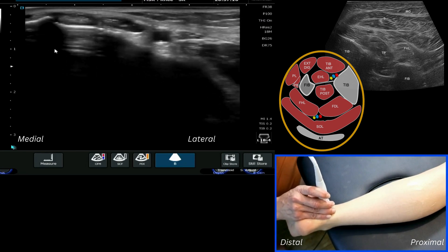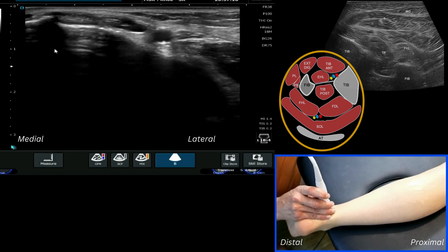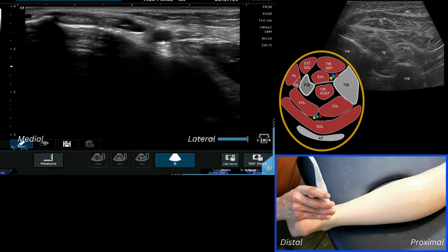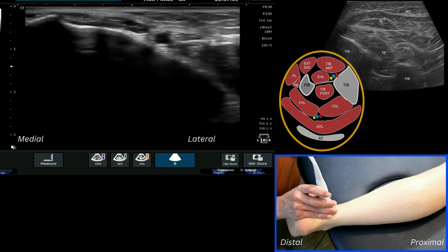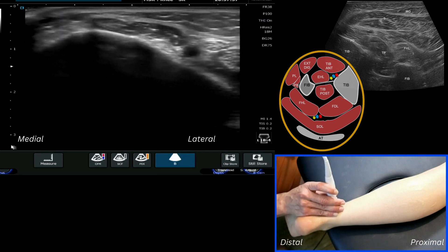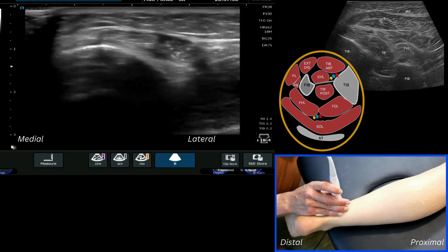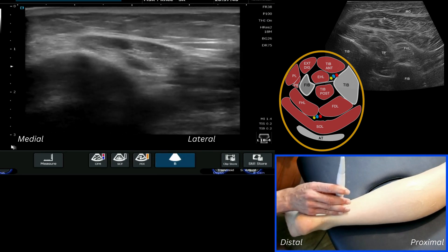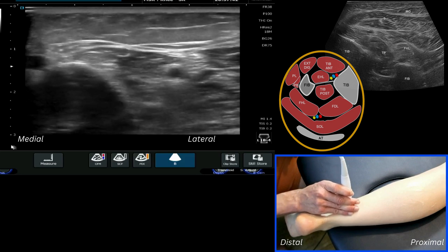At the tarsal tunnel we can identify the tendons: we've got tibialis posterior here, we've got flexor digitorum, the posterior tibial artery, the posterior tibial nerve, and FHL. As we then start to move up, we can focus on following some of those tendons as they become musculotendinous junctions and then become muscles.